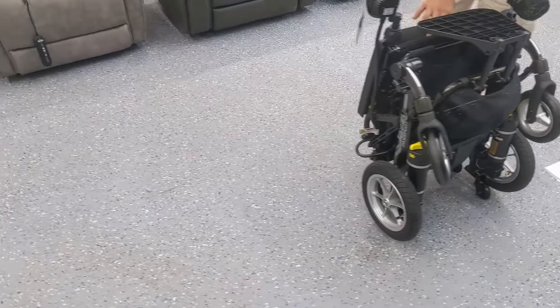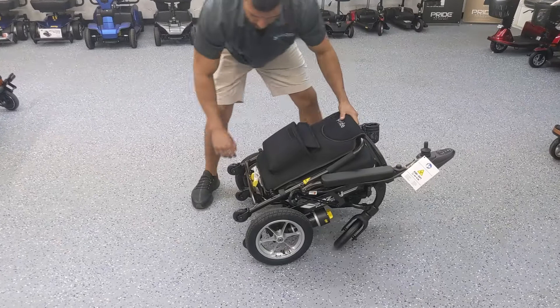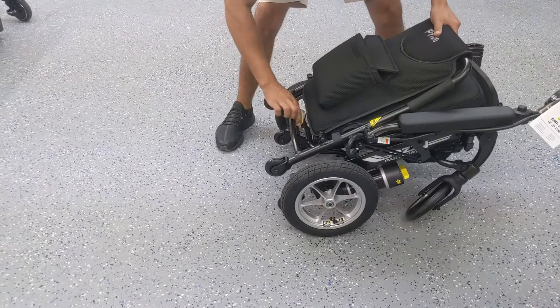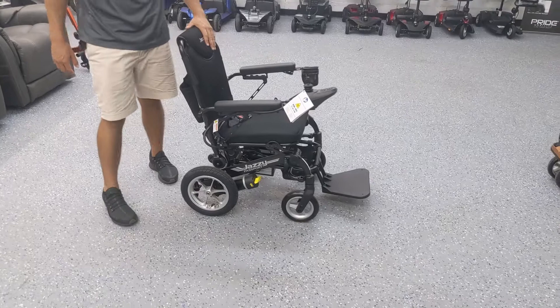Let's go ahead and unfold it. To do that you want to lay it back down. Wheeling it around is done while it's standing up, but if you want to unfold it you have to lay it back down and compress the two clips while pulling the seat up. It might be a little stuck — you have to give it a firm press — but once the clips release you can unfold it back into the unfolded position.